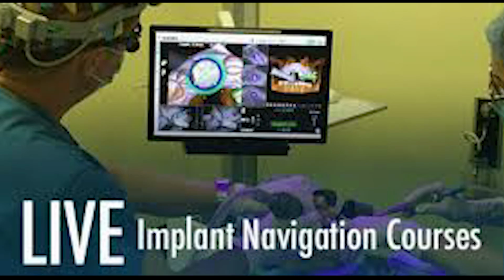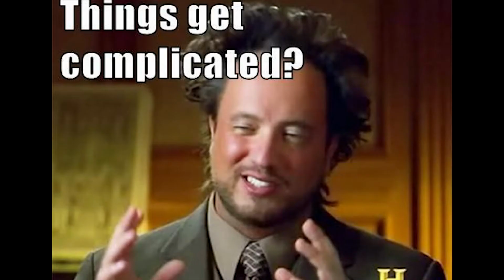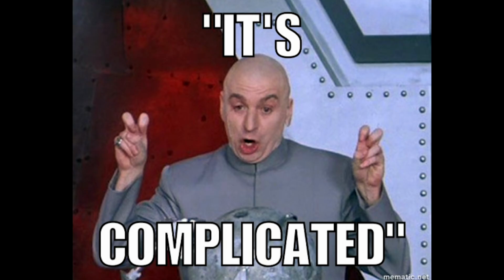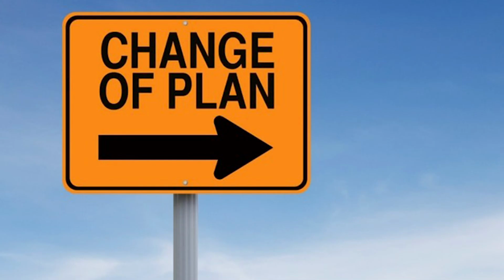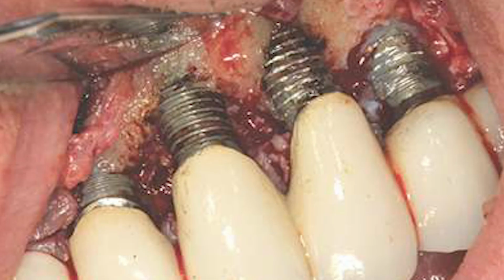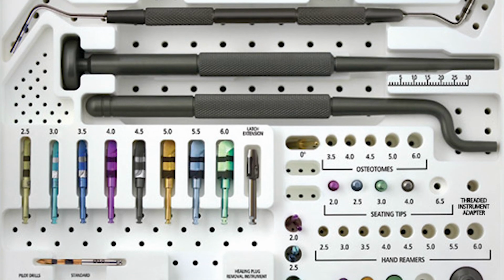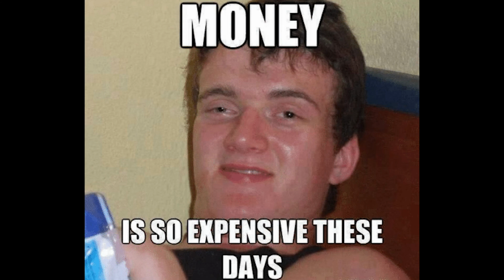Also, the dentist, the user, must learn the planning software, and it's very complicated. It takes a long time to get used to a whole new system and a whole new software. And any unexpected situations during surgery can be hard to deal with, like hemorrhage or cracking or anything related to the bone, the teeth, or the mouth. Also, as we said, it's a very expensive machine, and the surgical kits and surgical templates must be purchased.